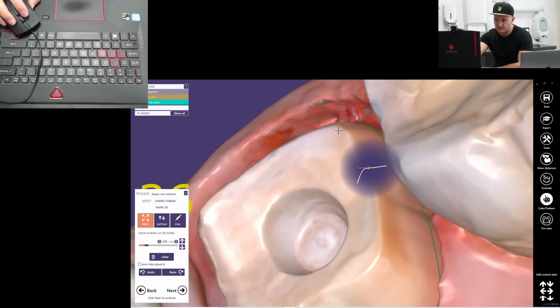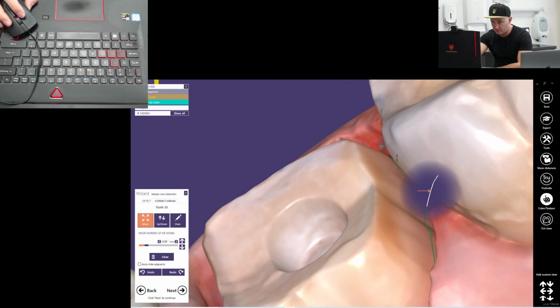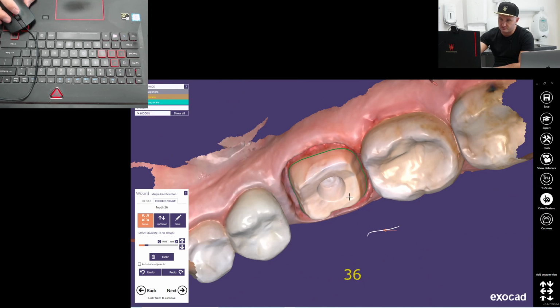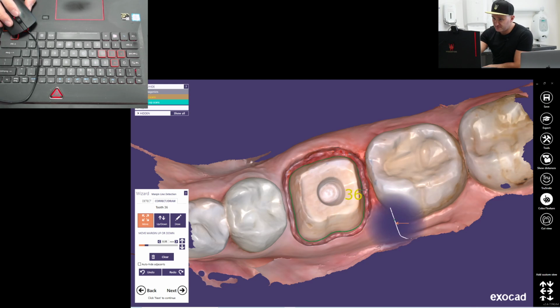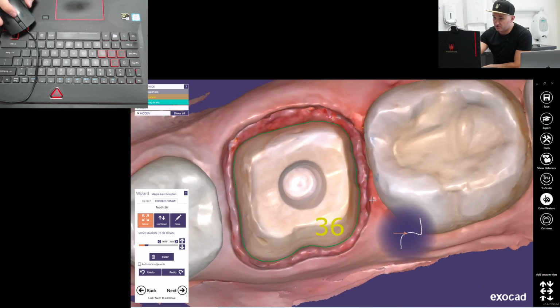This is because I use for my retraction no retraction cord, no Teflon tape, as some people recommend. I use laser, and diode laser in fact in this case, and as you can see, everything is very well coagulated, not carbonized.